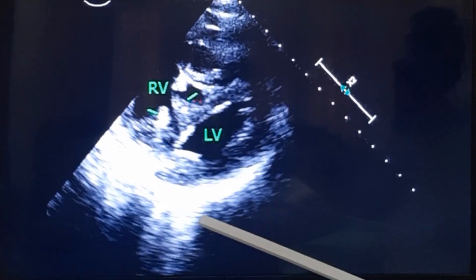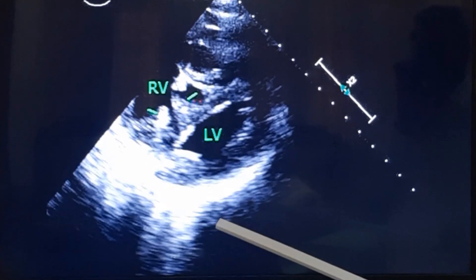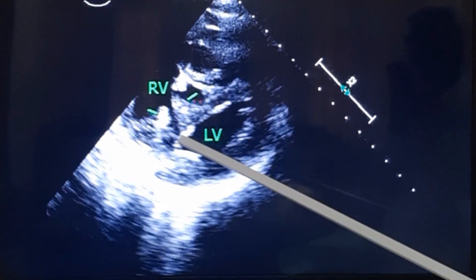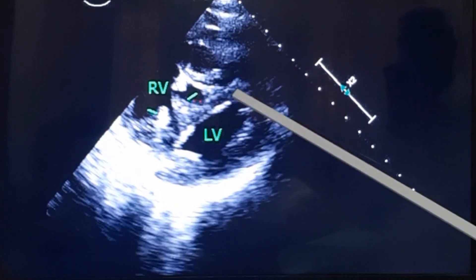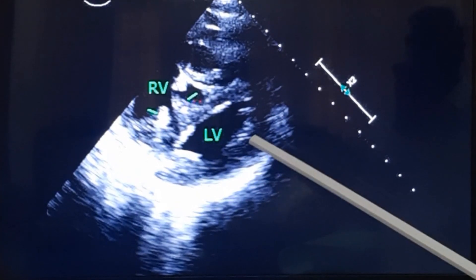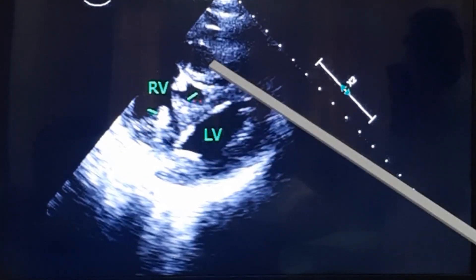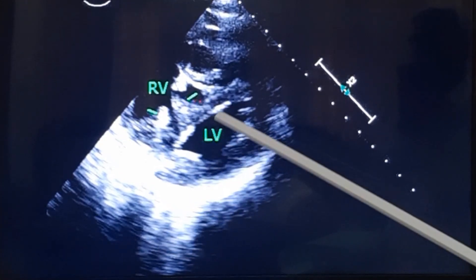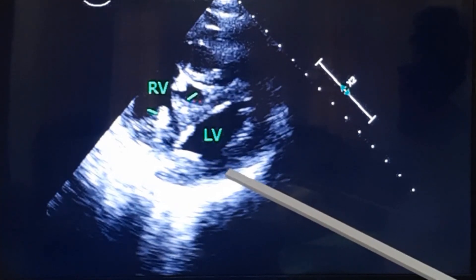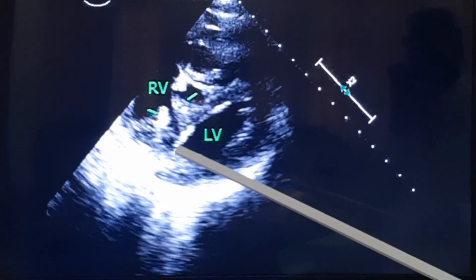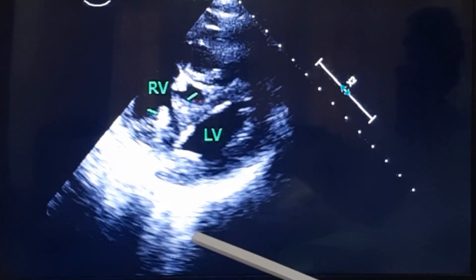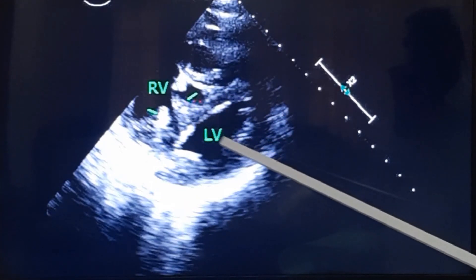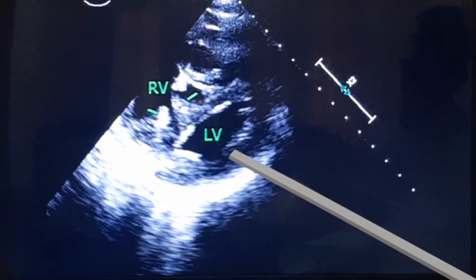This is an echocardiogram in the parasternal short axis view showing severe right ventricular hypertrophy due to pressure overload. You can see that the interventricular septum is flat and the left ventricular cavity is D-shaped, giving an abnormal eccentricity index. There is also gross hypertrophy of the right ventricle and the papillary muscles are also hypertrophied. This is a typical case of right ventricular pressure overload in severe pulmonary hypertension. D2 is measured parallel to the septum, D1 perpendicular, so D2 divided by D1 will be more than one.